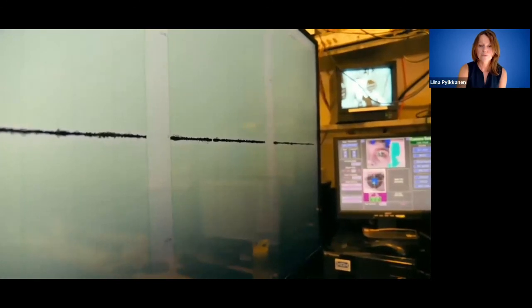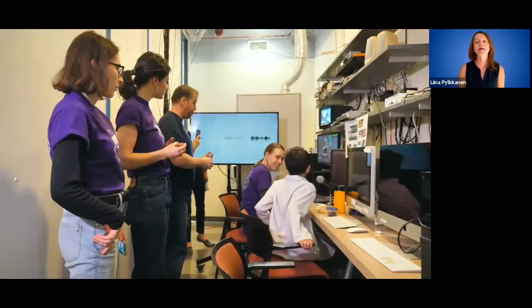And we're able to visualize the fluctuations in the magnetic fields millisecond by millisecond with incredible temporal accuracy as you're lying in the machine. And then, of course, we save all that data and analyze it later with respect to whatever the question is that we're interested in.